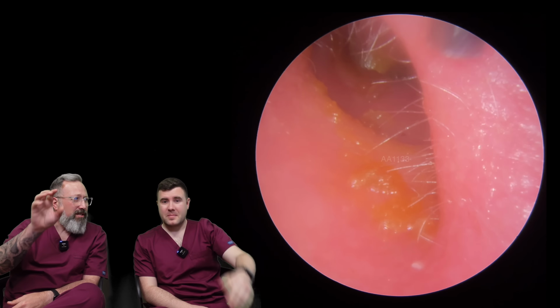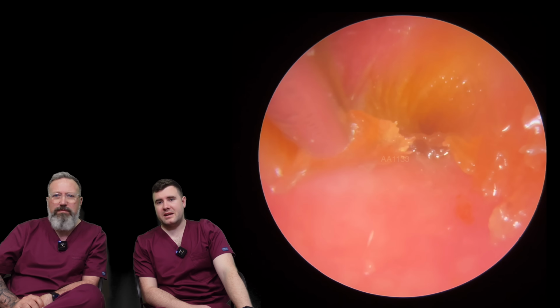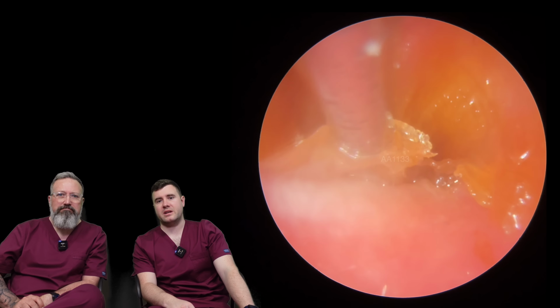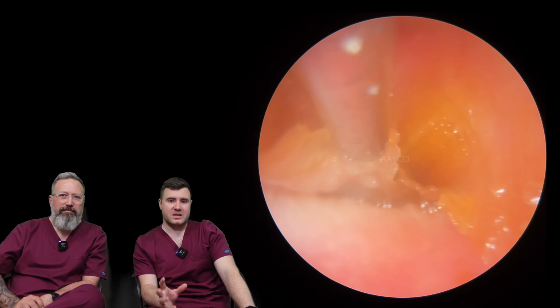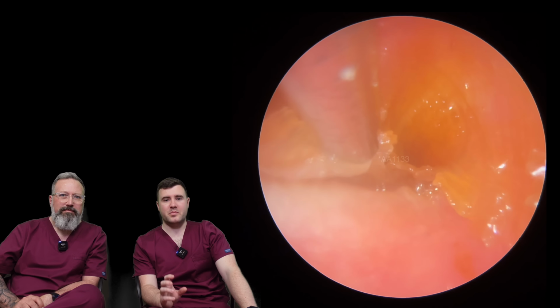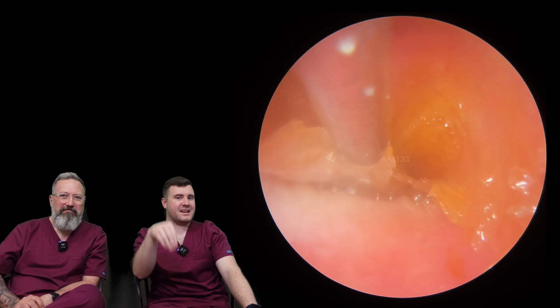So it starts off, this is you started, isn't it? Yeah, me starting off doesn't actually look that bad, to be honest. When I first started, I thought, oh, it's just a little bit of dry skin, the usual sort of, you know, peel it away, should come away nice and easy. But the problem we've got with this particular patient's ear canal is he's got a very deep and prominent recess, and we can't get in that sort of area.